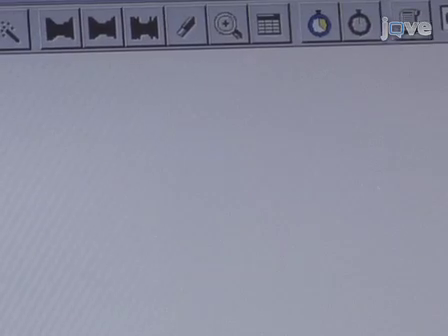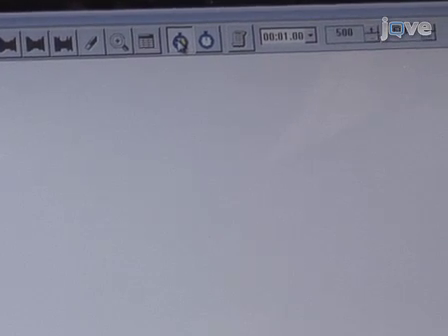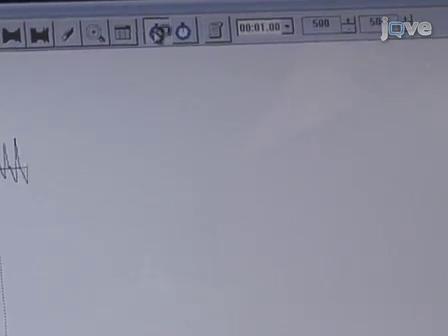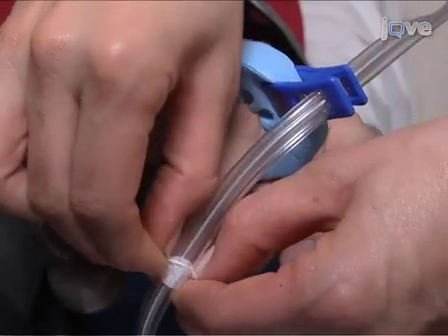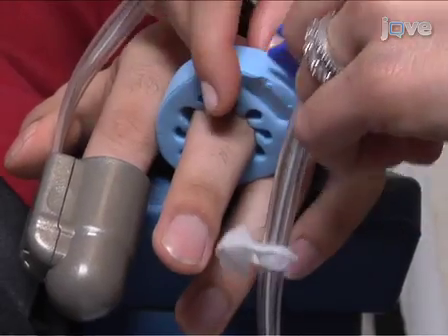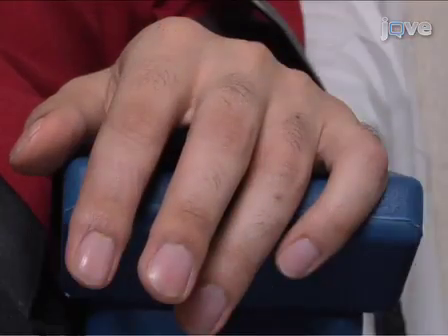the timer. Click the Start-Stop Timer icon again to initiate a 5-minute post-occlusion recording period. Stop the timer after 5 minutes and click the Test Stop icon to complete the study. At the end of the study, remove the probes, tape, and foam rings from the patient's fingers. Disconnect the PAT probes from the pneumoelectrical tubing and discard these probes.